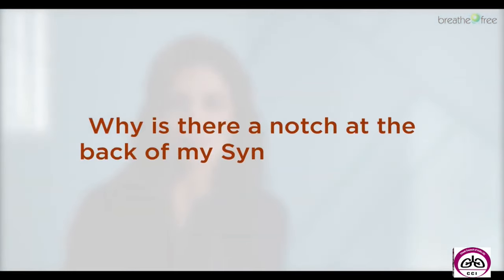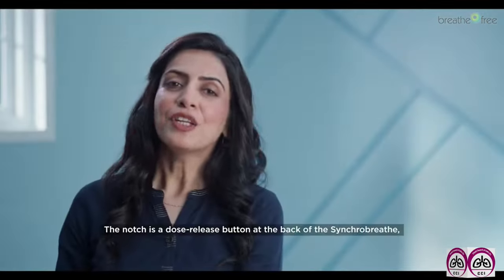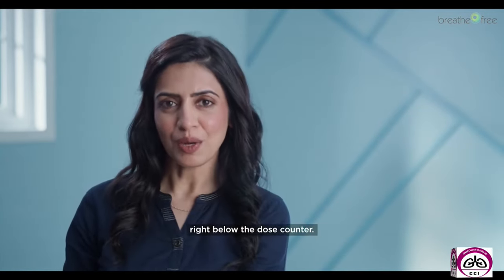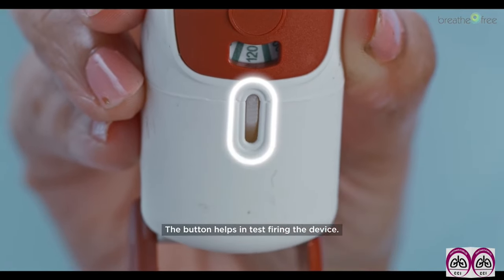Why is there a notch at the back of my SynchroBreathe? The notch is a dose release button at the back of a SynchroBreathe, right below the dose counter. The button helps in test firing the device.